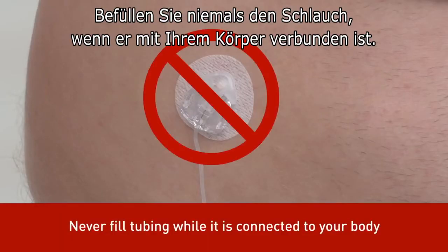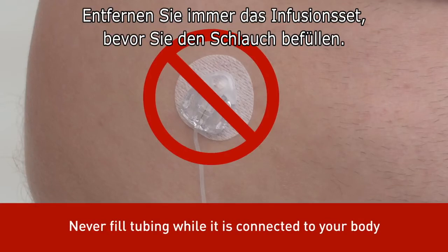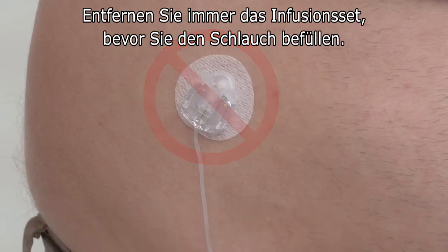You should never fill your tubing while your infusion set is connected to your body. Always ensure that the infusion set is disconnected from your body before filling the tubing.